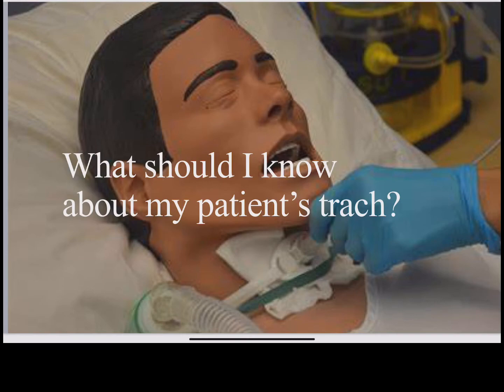Questions you should know about your patient's trach. Well, let's see. We want to know, what type is it? Is it a cannula disposable or non-disposable? Is it a Shiley? And what size is this? Is it cuffed or not cuffed?